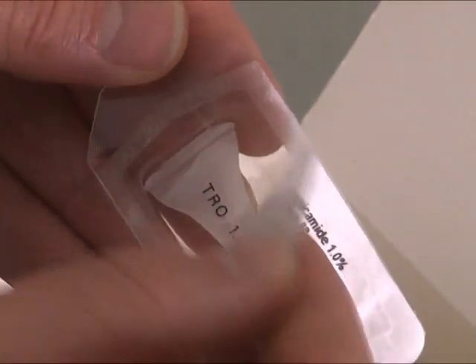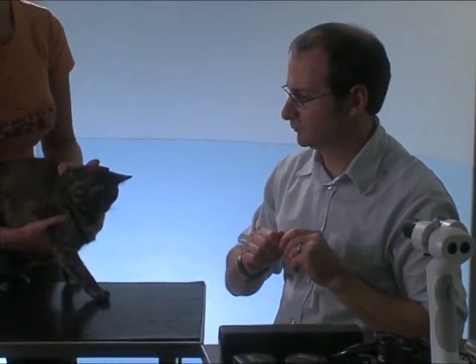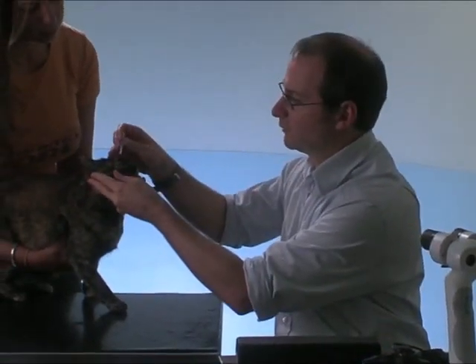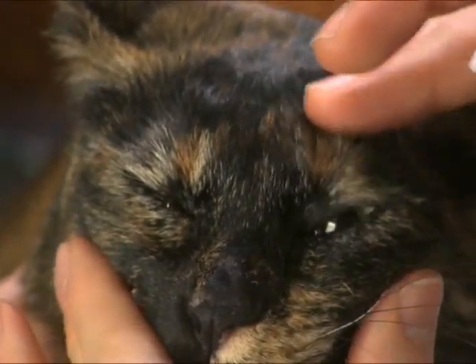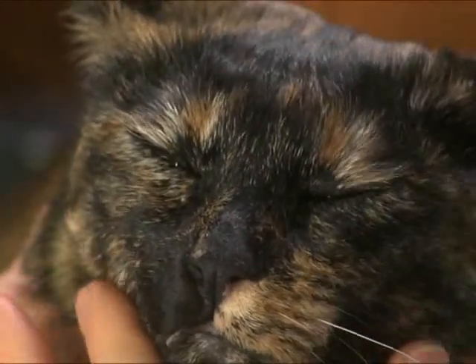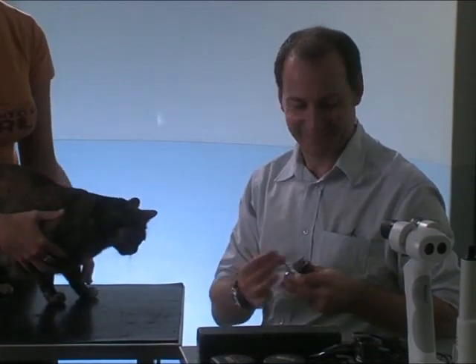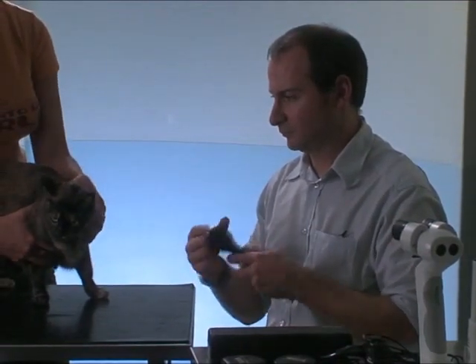Close direct ophthalmoscopy requires an adequately dilated pupil. It is often possible to make a cursory inspection of the fundus without first dilating the pupil, but if a more detailed examination is indicated, a short-acting mydriatic should be used. Approximately 20 minutes are needed for the pupils to dilate fully. If glasses are worn, they should be removed for this procedure. The lens cartridge should be adjusted to a suitable setting, in the case of this examiner to -2.